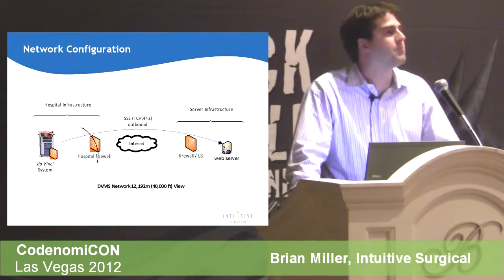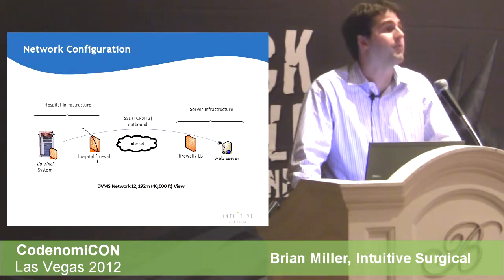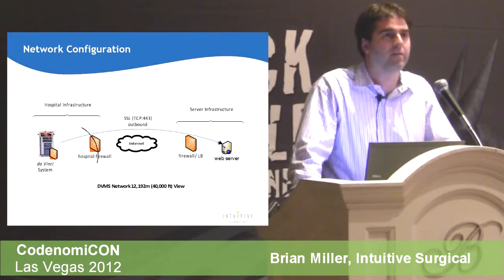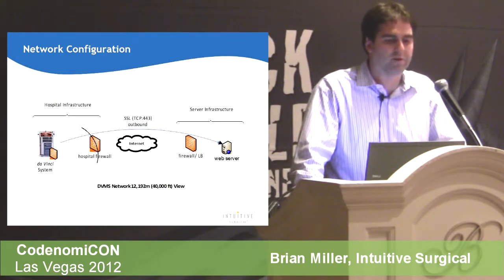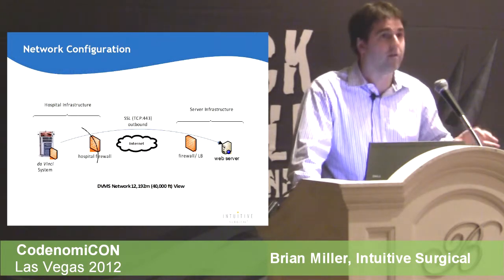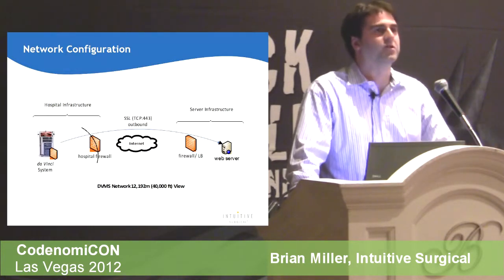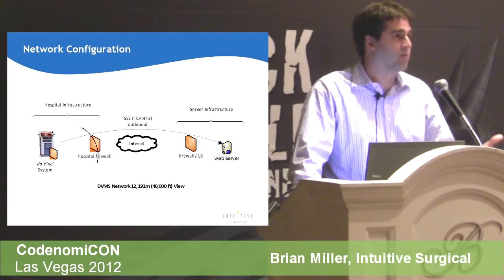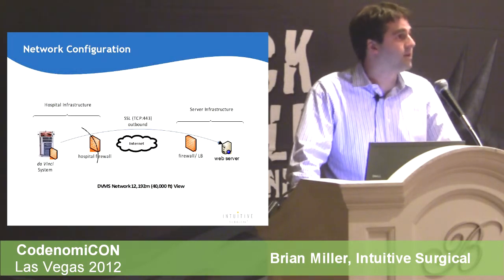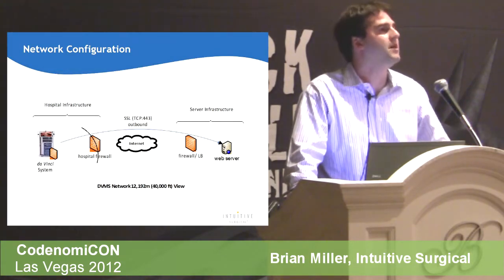And so to address that uptime and trying to make sure that those systems were online, so our customer support team had the benefit of the servicing capability, we found CodenomiCON, we brought in their test suites. And what we found was that when we used the DNS server suite, and we had our system as the DNS client, we were able to go through all the different variations of DNS responses, and we found that there was a certain signature and a certain class of responses that the DNS client was unable to parse. And so then our safety systems kicked in and said, I don't understand this.